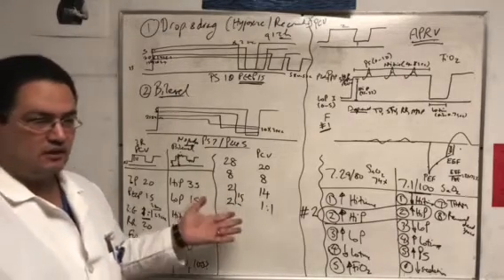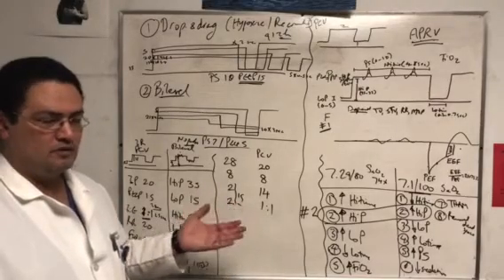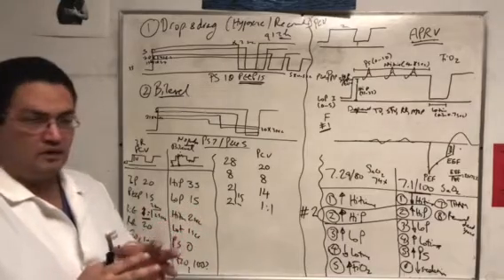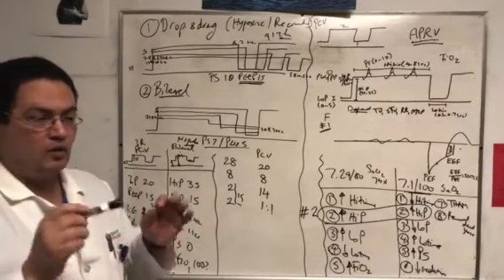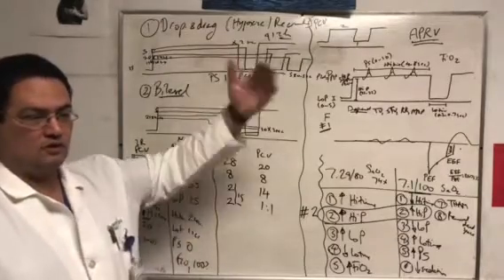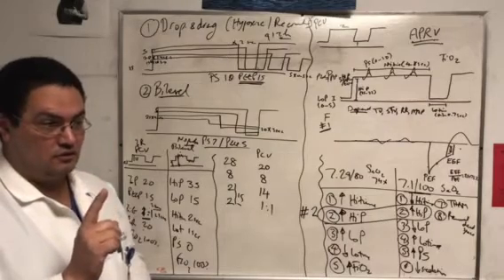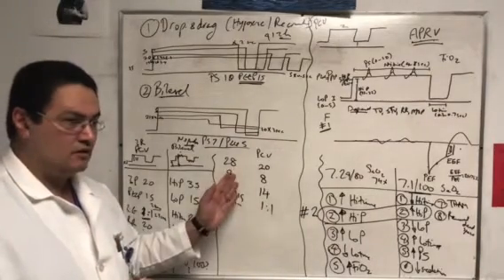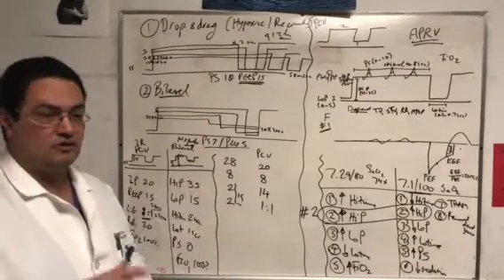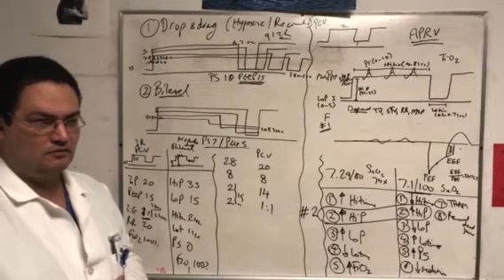The hypothesis of the study is that APRV, at an equivalent minute ventilation, will give you more ventilation, more towards alkalosis. Like you give me 5 here and 5 here, that 5 here is more valuable than this, and that's what we noticed. The most common gas. Have you noticed the most common gas in Brockton ICU is what? Maybe you didn't notice.